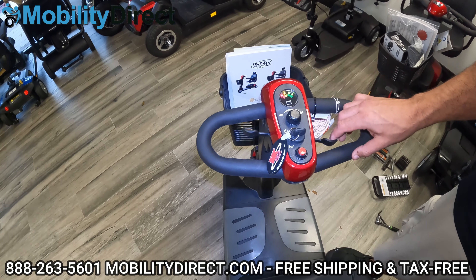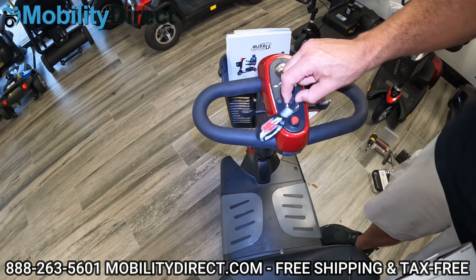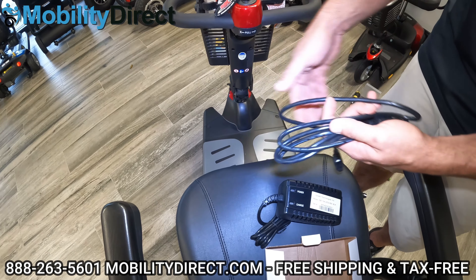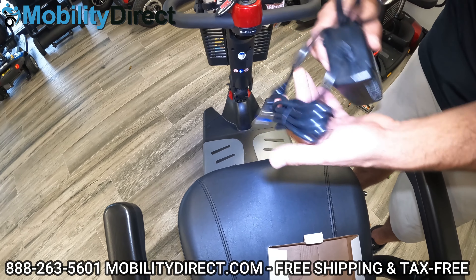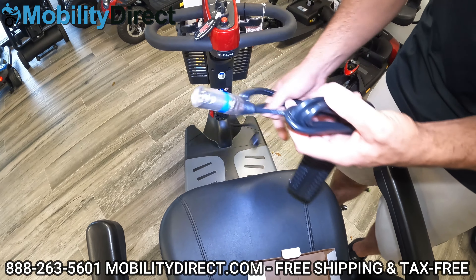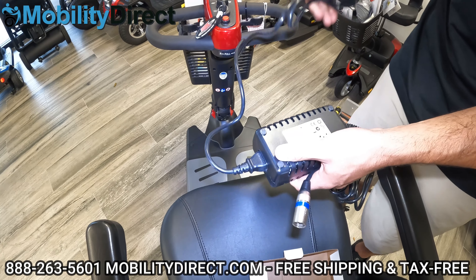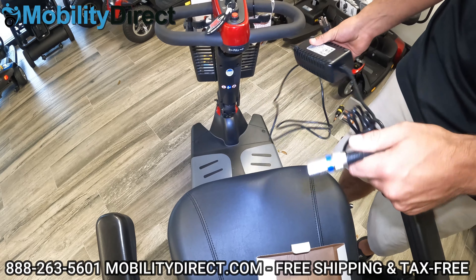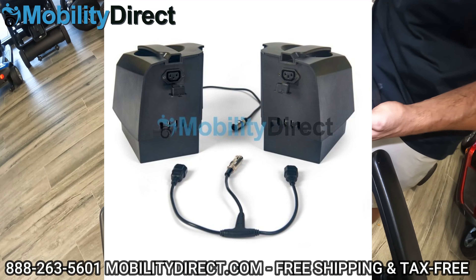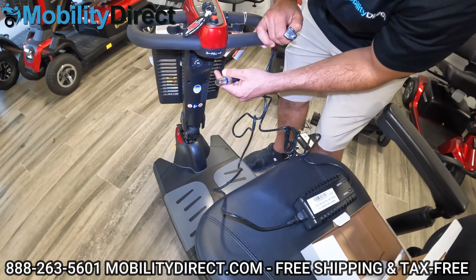You could turn the speed down or turn the speed up. You've got a horn and a charging port — which is really important. We're going to need to charge it for the first time. You don't want to go out and start using it right away — take the charger out and give it a good initial charge. If you can, just leave it overnight. You can also get an adapter as an accessory that lets you charge the batteries while they're disconnected from the scooter — convenient if you want to leave the scooter in your car and bring the battery boxes inside to your hotel room.